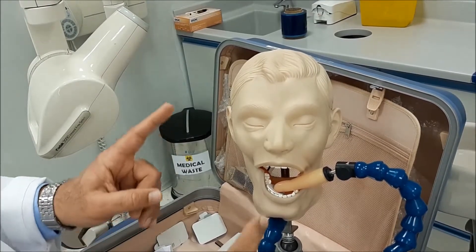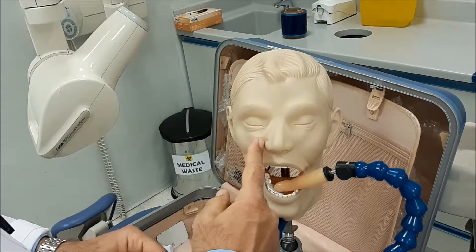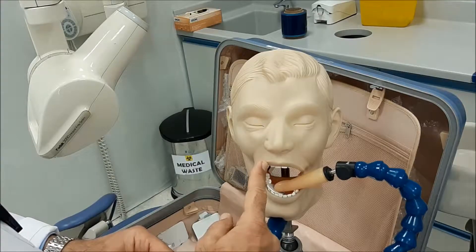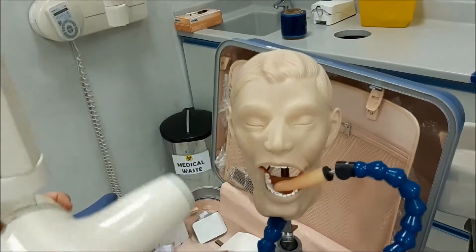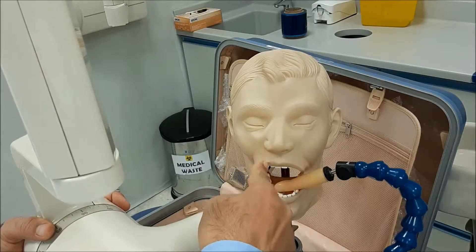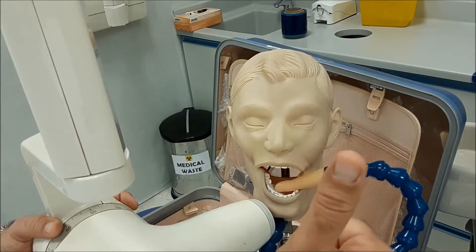After the sensor is positioned, we now start directing our beam. The point of entrance will be along a line extending from the ala of the nose, which passes through the upper canine. If you extend it downwards exactly, it will be on the lower canine. So the point of entrance will be along a line extended from the ala of the nose, whether it is a right tooth or a left tooth.